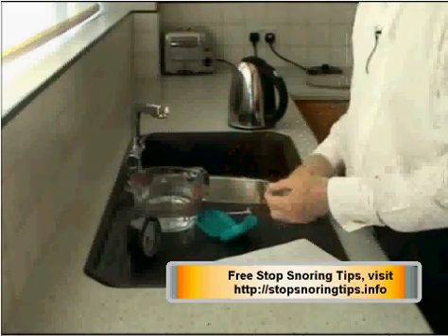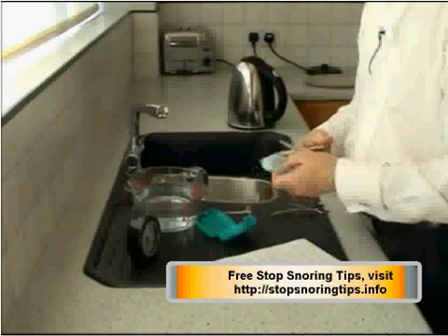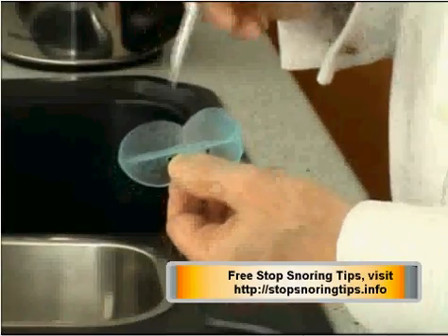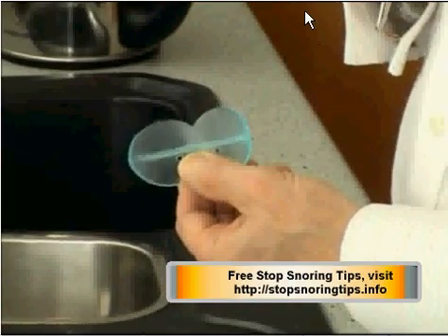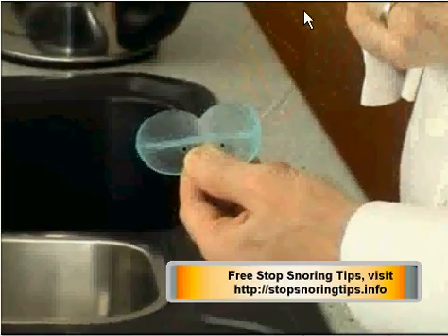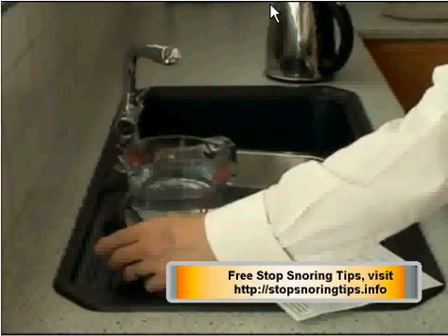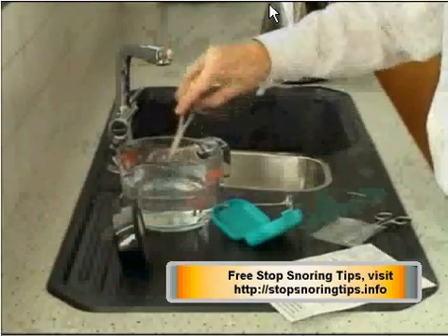The device is going to be popped into the water for 1 minute, but let's just have a look at it first and make sure we know which way is up. This small arrow here denotes the top of the device. The holes are in the bottom. So we'll pop it in for a minute. You'll find that it shrinks quite a bit.